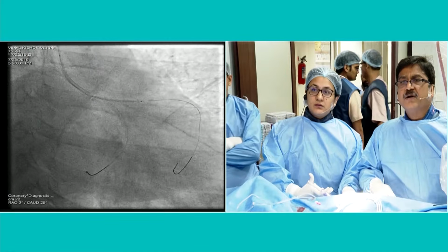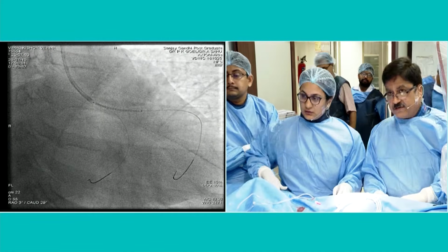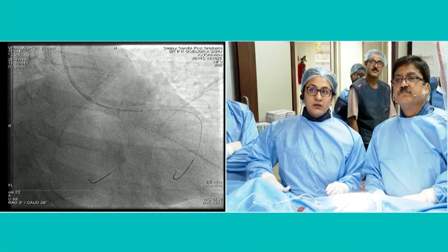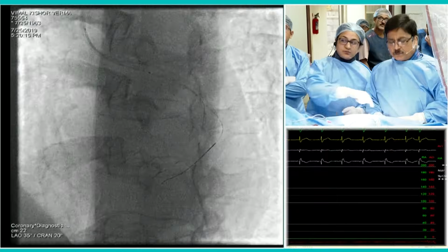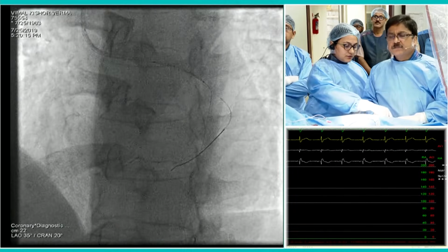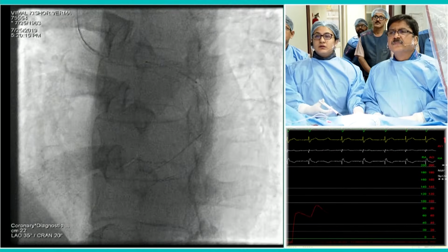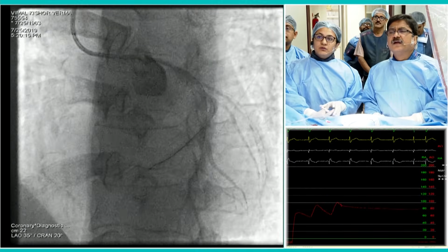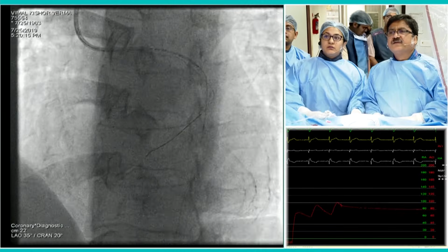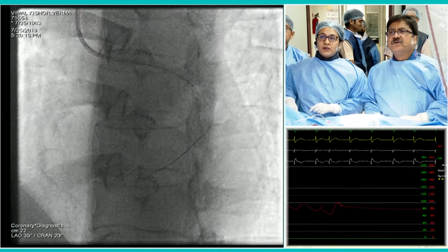Dr. Luca, you have experience of this stent. I believe you can pass on some comments about it. Well, actually, I lost the size of the stent. Which is the stent? 428, I think. What 428? Okay, 424. This is 424. That's good for the implantation. But anyhow, this is 24.